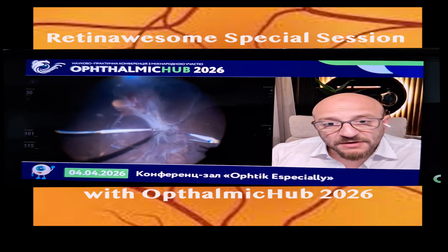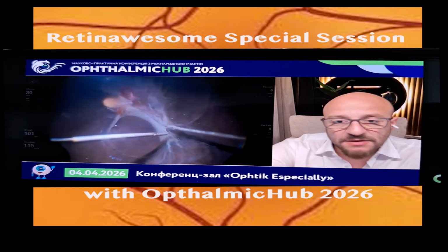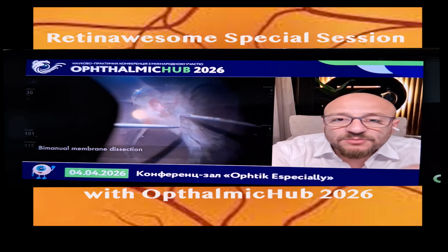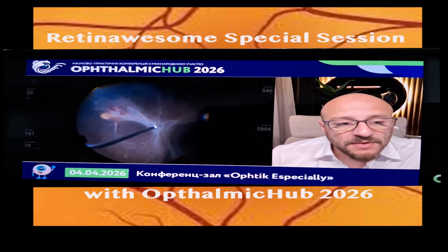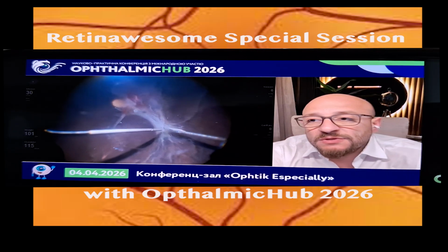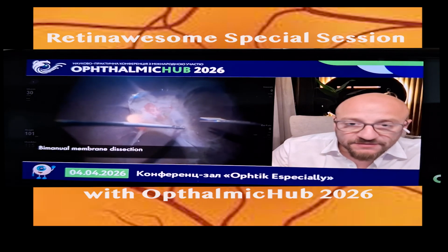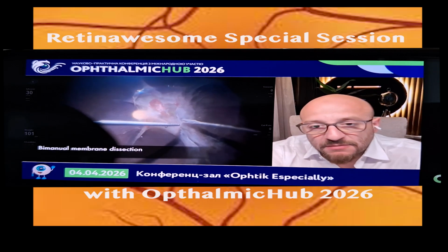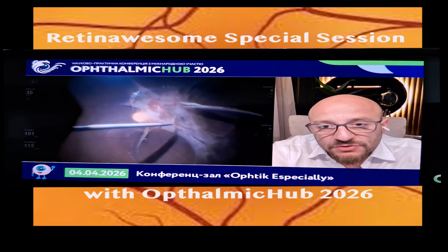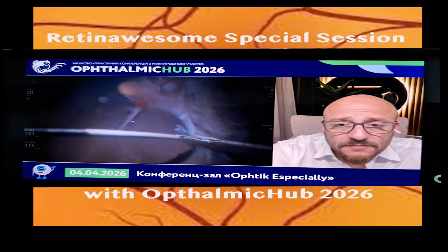Here I'm using bimanual vitrectomy and bimanual maneuvers, and I'm using this forceps, which is a loop design forceps with a protrusion in one of the blades, to use it as a pick to be able to lift and catch the membrane. I'm using here the bimanual technique, which I usually use with posterior pole membranes.